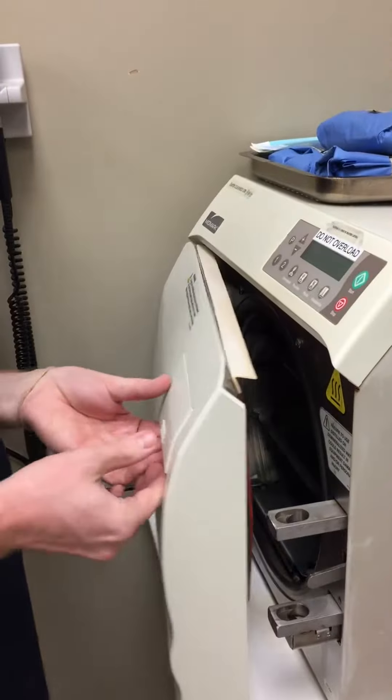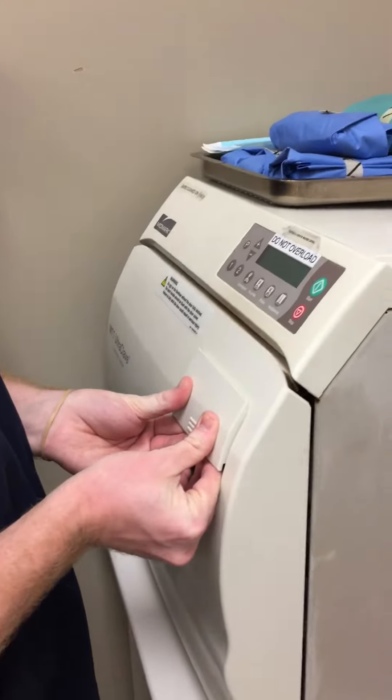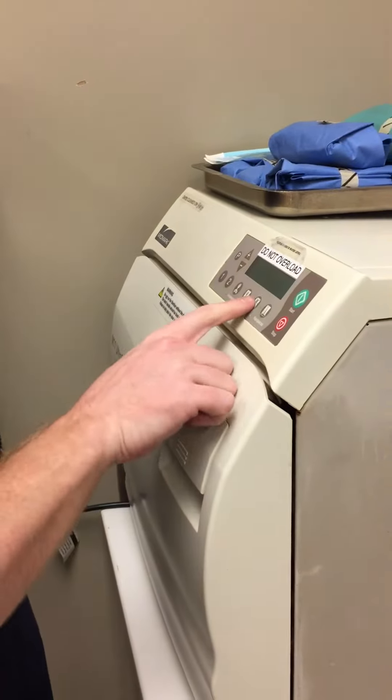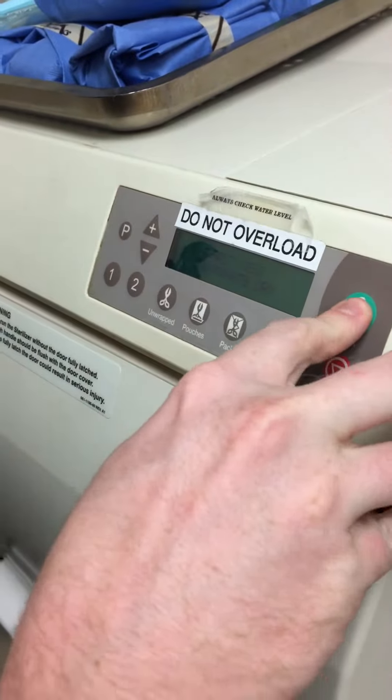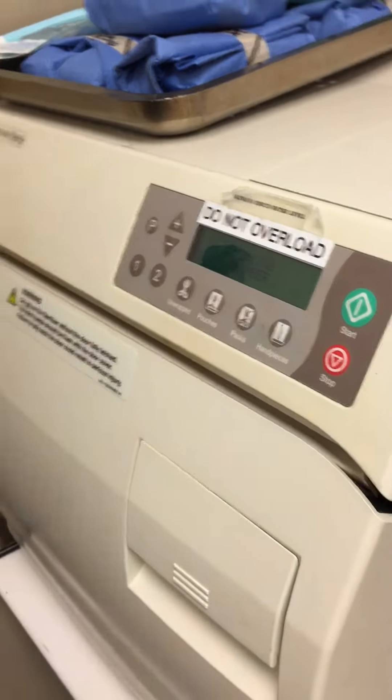I'm going to go ahead and start the machine by pressing the PAX button right here, and start. And that's how you operate and maintain an autoclave machine.